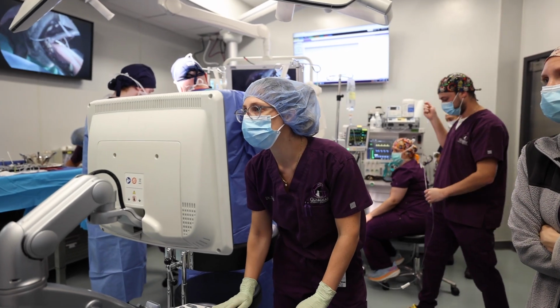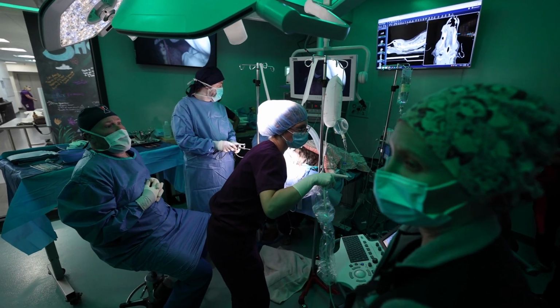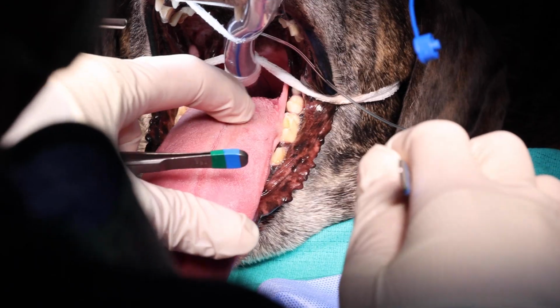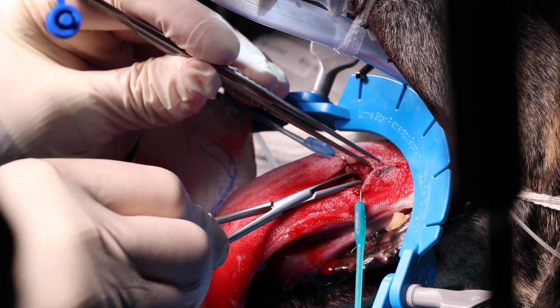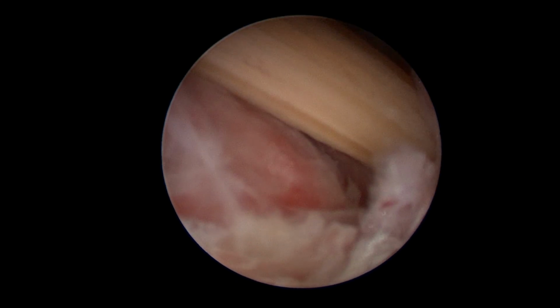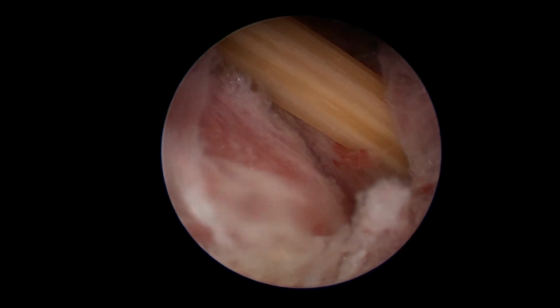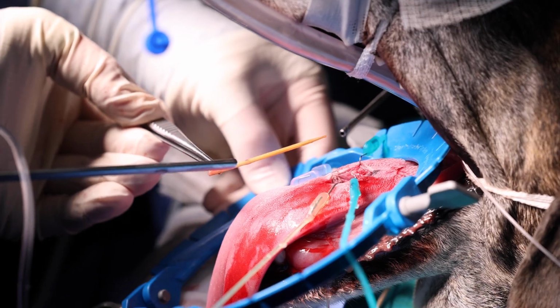What my team and I were able to do was locate this on the CAT scan and use Dr. Sirois' ultrasound to tell us the exact location of this. We then made a very tiny incision and placed a scope into the incision near where this little skewer foreign object was. And I was able to find it with a camera and then use another instrument to grab it and pull it out with the aid and guidance of the scope.